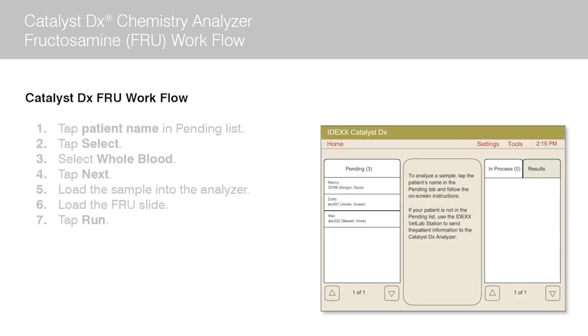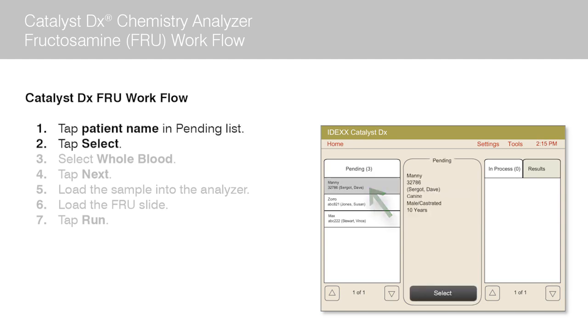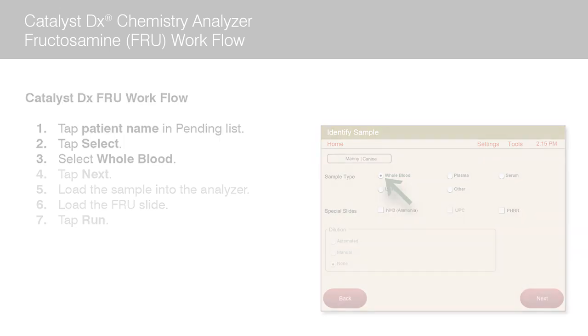Next, you will need to queue up your patient on the Catalyst DX Analyzer. Once the patient's name appears in the pending list on the Catalyst DX home screen, tap the patient name and then tap select. Select whole blood as the sample type on the identify sample screen.